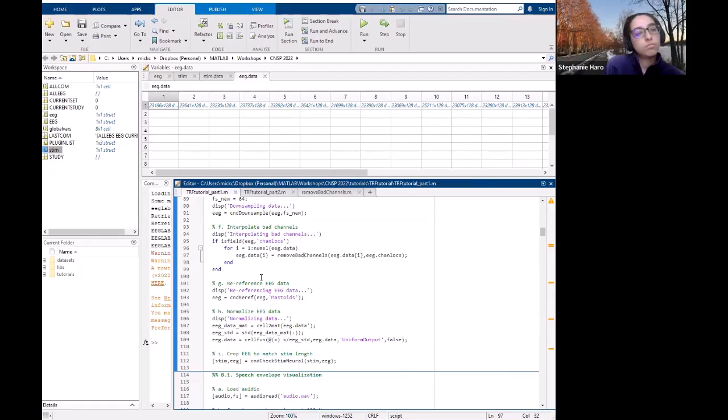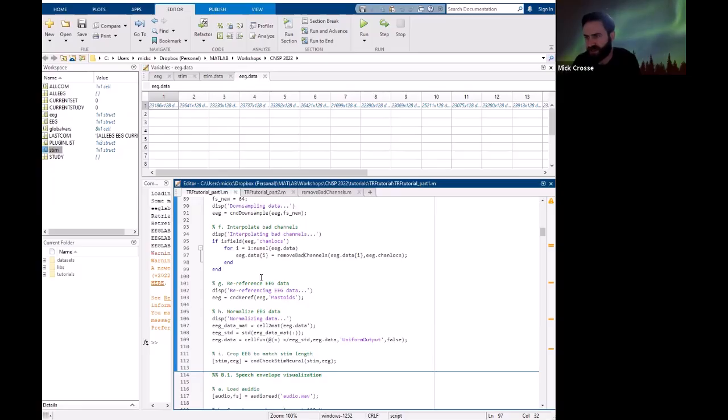So it's just a very simple way to clean your data instead of actually trying to recover the signal by some more sophisticated method of removing the artifacts or the noise. We're just going to say, because of the autocorrelation between channels with the EEG, because of volume conduction, we can basically infer what the signal should look like from the surrounding good channels.